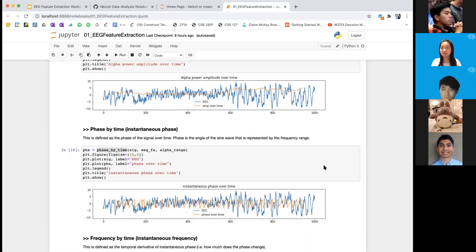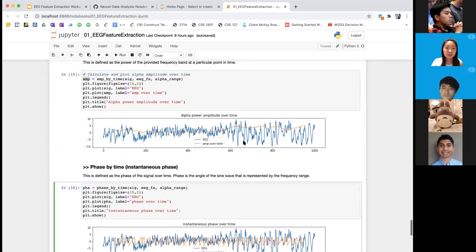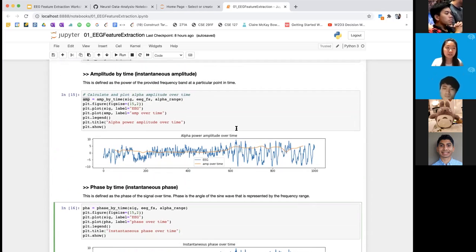So would we concatenate all trials together and then get the standard deviation across all? To clarify, I would say you should aim for features for a single trial, because you want as many features for a trial as possible. You want information about your EEG data for that one trial in order to classify it later on.